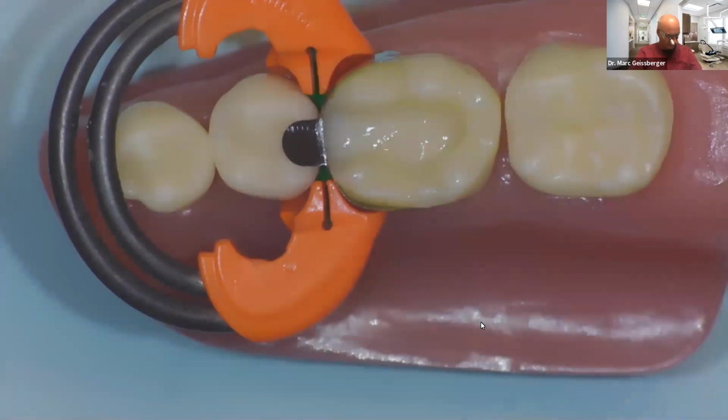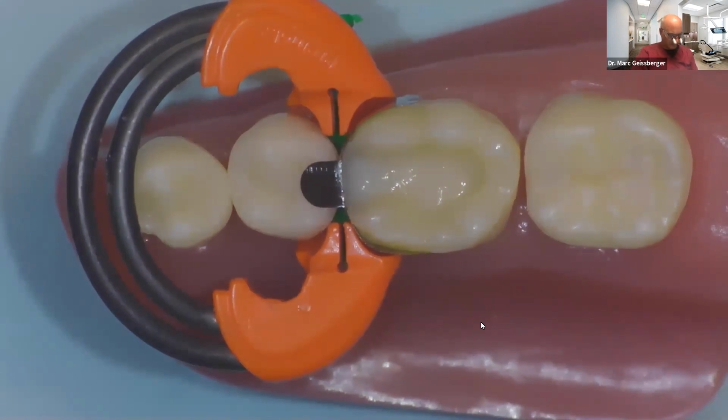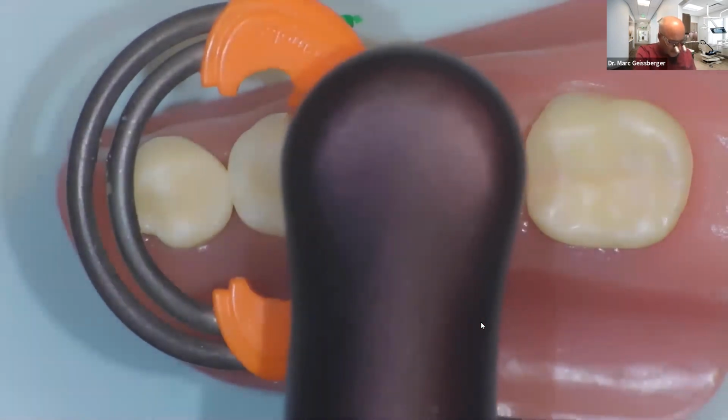Now what we're going to do is, my assistant knows that as soon as my finger leaves the patient's tooth, she is in there shining with a light.